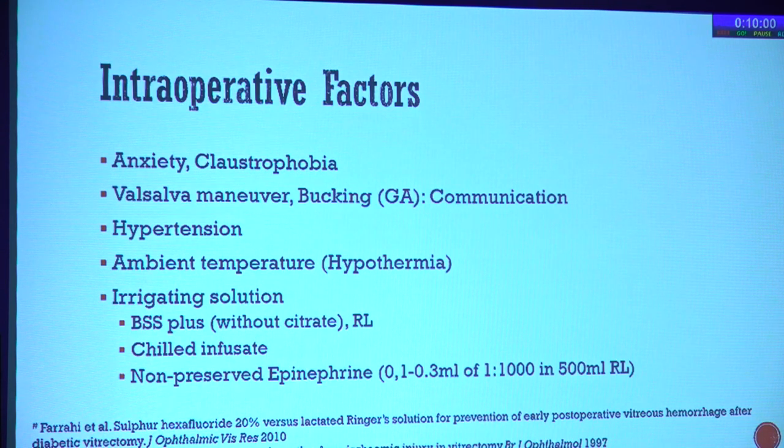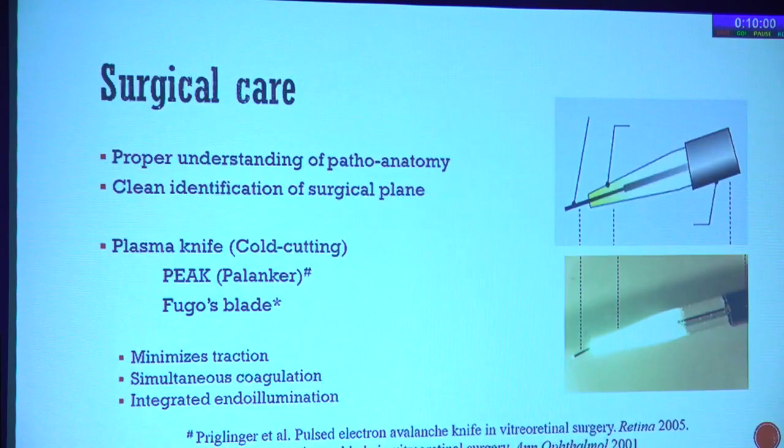The chilled infusion not only creates good hemostasis, but also increases the tolerance to ischemia. The retinal tolerance to ischemia is much better when the infusion bottle is chilled. In some cases, you can use epinephrine in the Ringer's lactate infusion bottle.